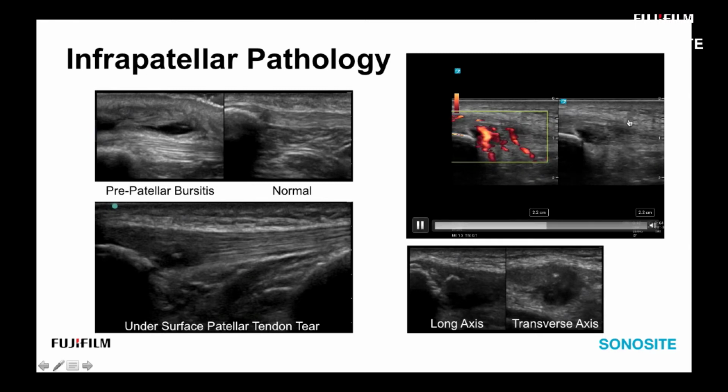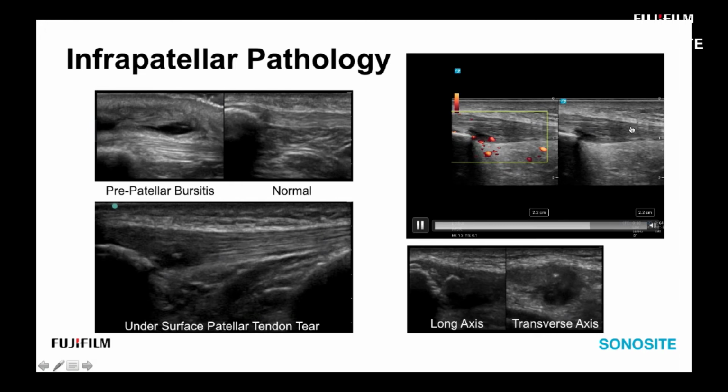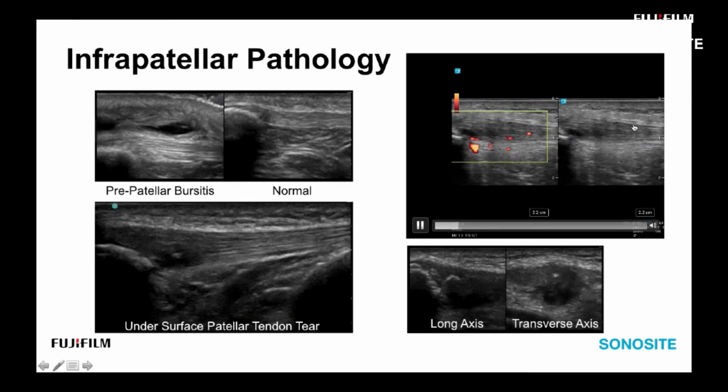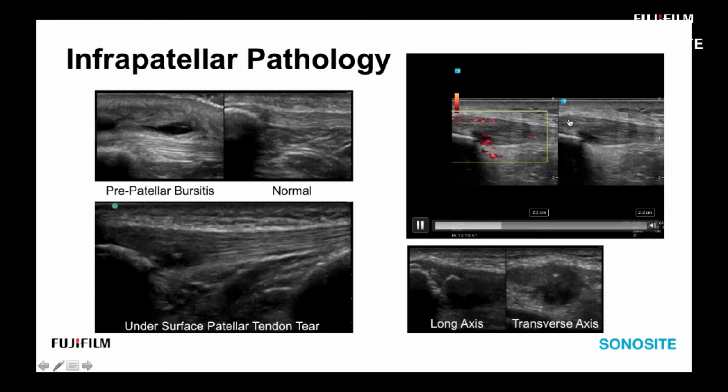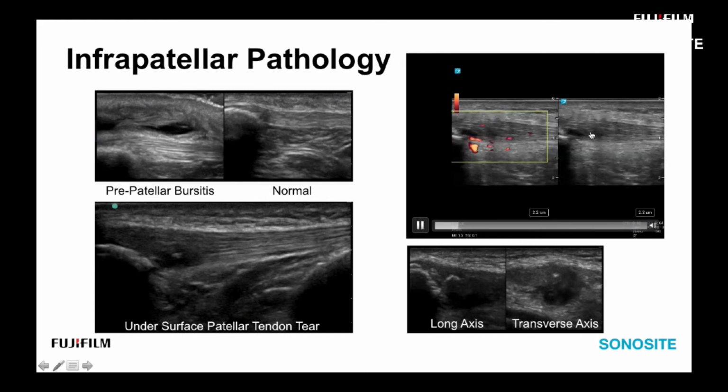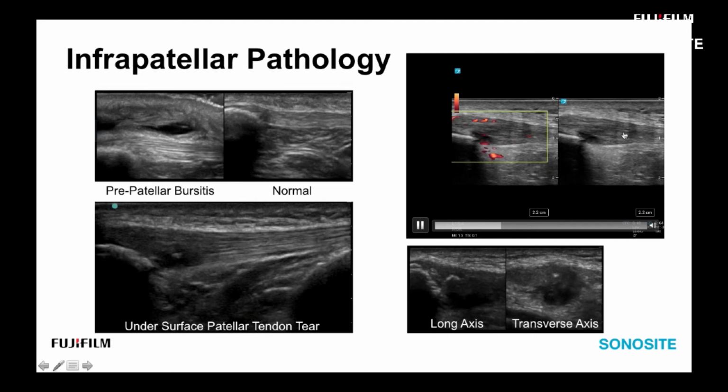And you come over here where we have tendinosis, and you notice that these fibers tend to fan away from each other because they're loaded with fluid or degenerated architecture that no longer is longitudinally oriented fibers. So within the structure here, we have a loss of fiber detail right down the center of the area of concern.